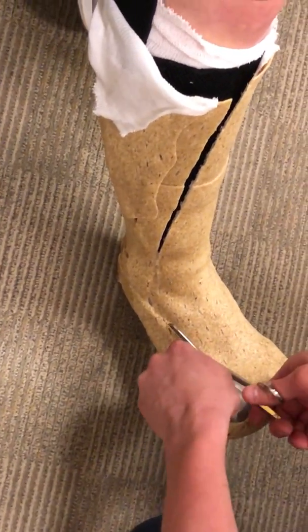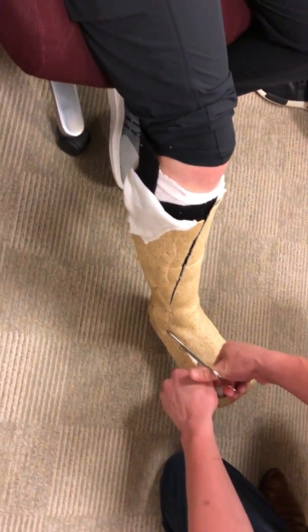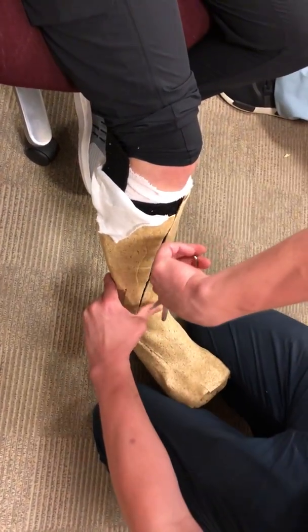And it's still even a little wet, which makes it even harder to cut. That's pretty cool.